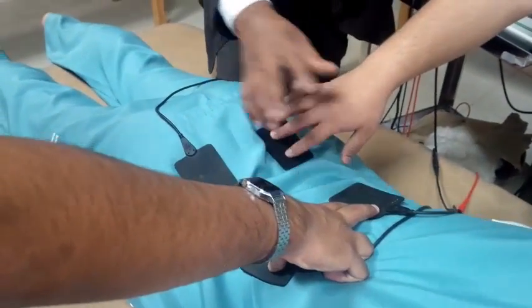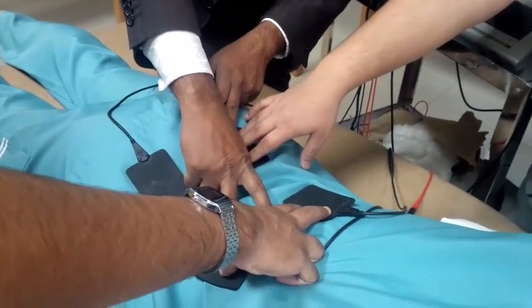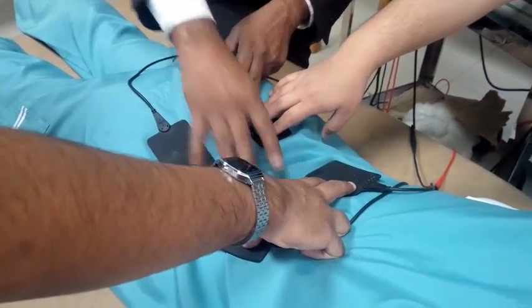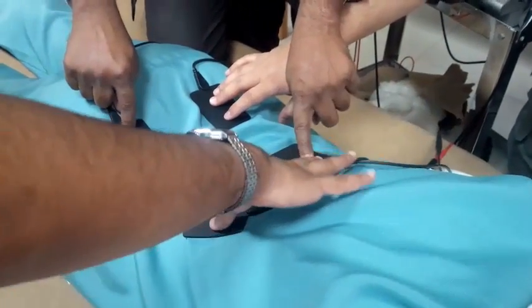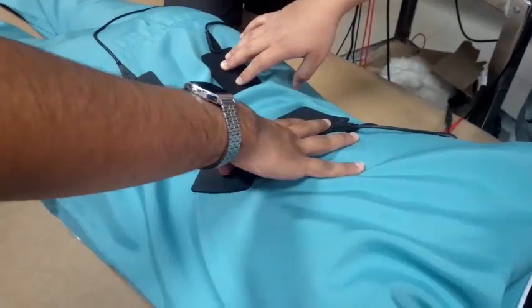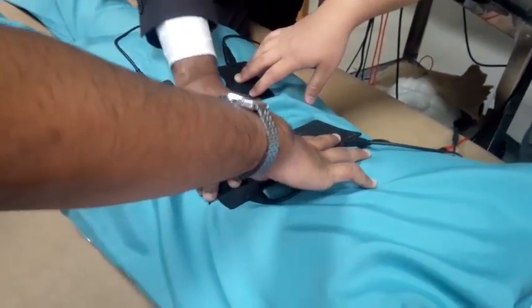So see, now I am having here, this is the channel 1. Say for an example, this one I am making it fixed frequency, for an example, 4000 Hertz. This channel 2 I can alter. So I can increase it to 100 or 200 more than 4000, or I can decrease from 4000 by 100 or 200. Okay. So how will the current pattern be going on?